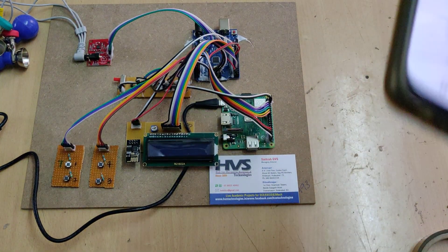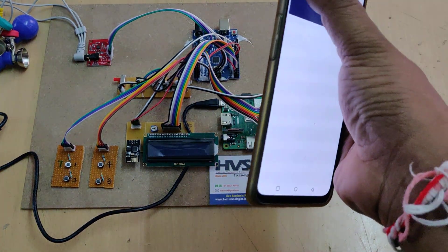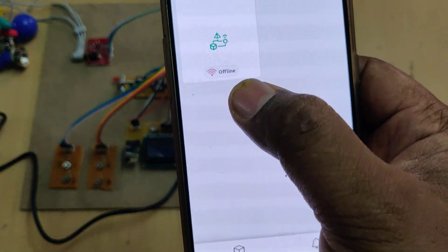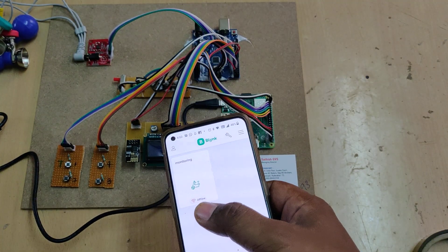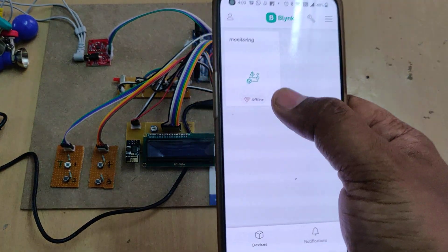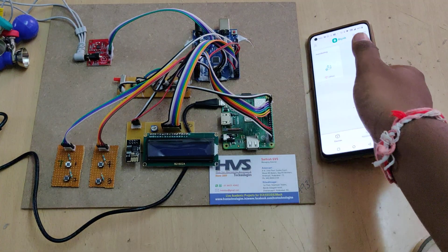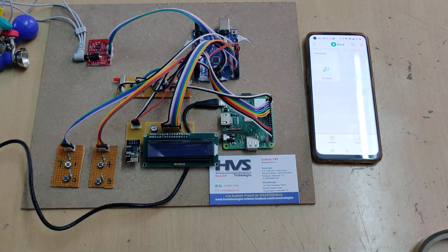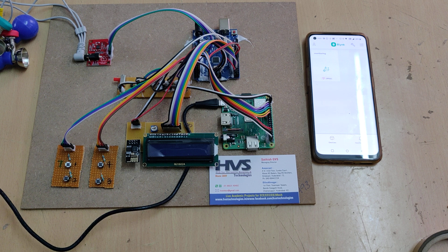After enabling the hotspot, log in to the Blynk application. You can see the device is offline, meaning the device is not yet connected to the internet, which is why it is showing offline.